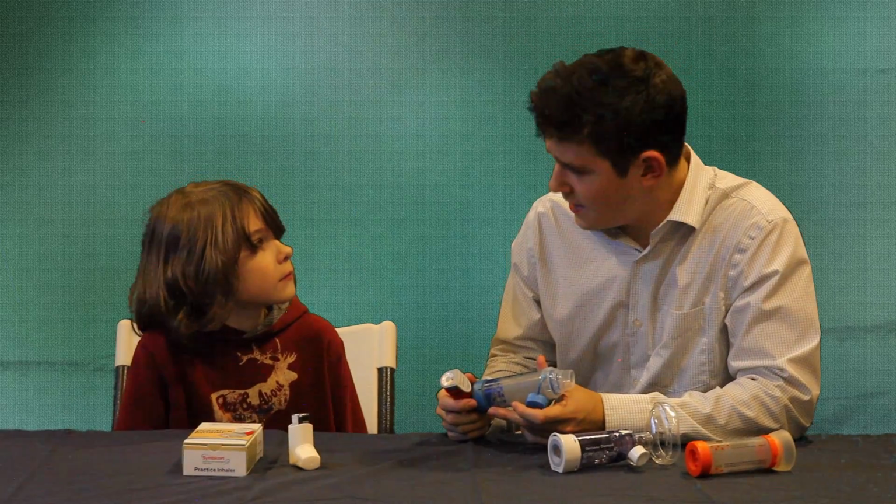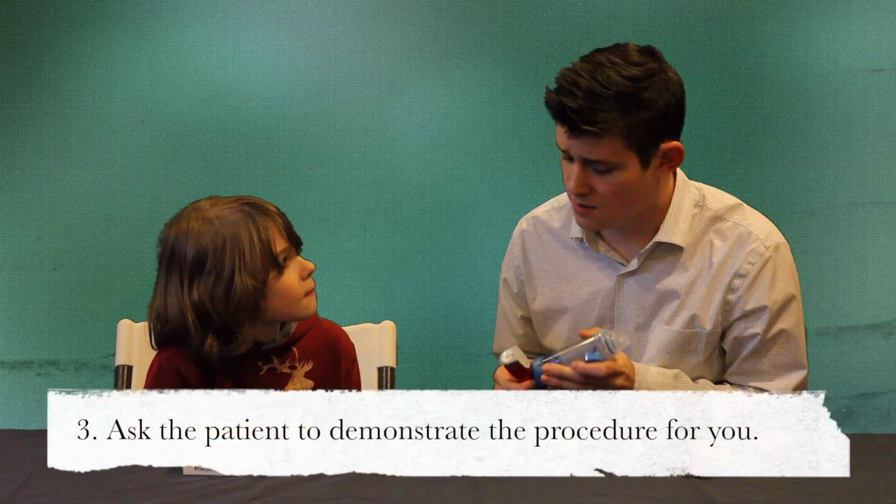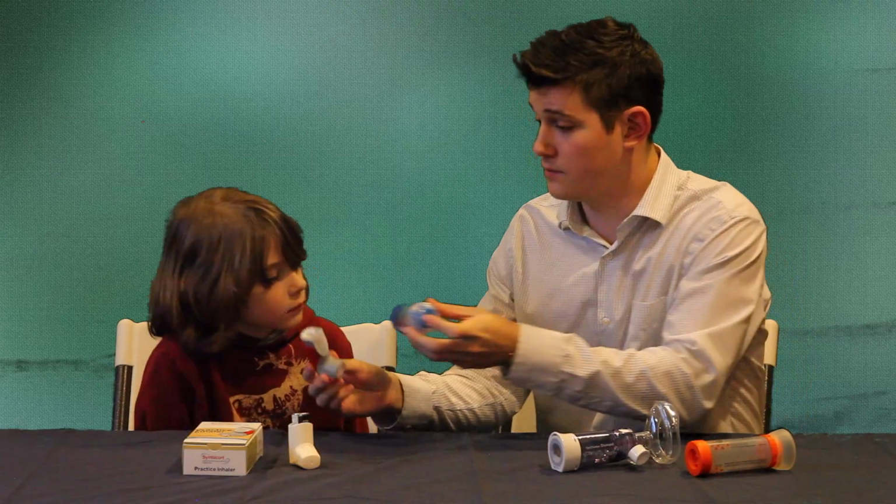Do a nice, big, full, slow, deep breath all the way in. And you can take the inhaler in or out of your mouth, and you hold for 10 seconds. You got it? Yeah. Okay. It's tough though, so we want you to practice, alright? So you're going to take these, and you're going to start from the beginning.